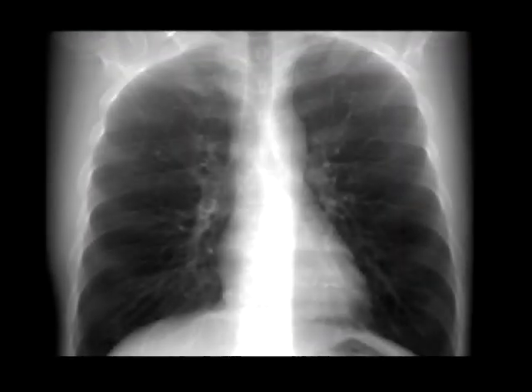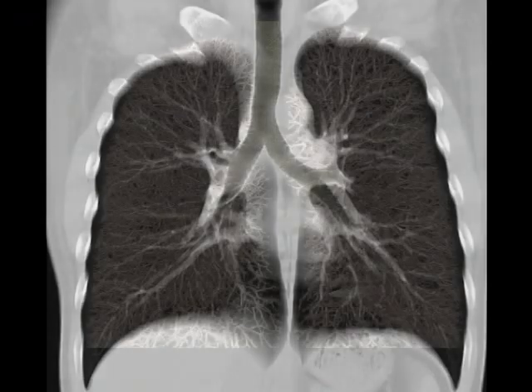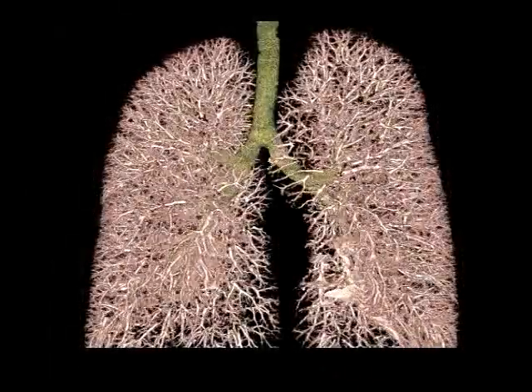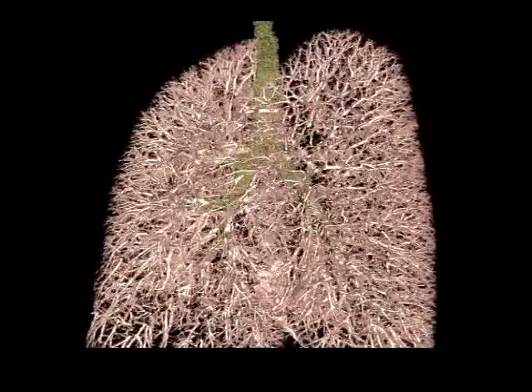This is not a plain radiographic image. This, too, is an image visualized by the Aquilion using a ½ millimeter slice.